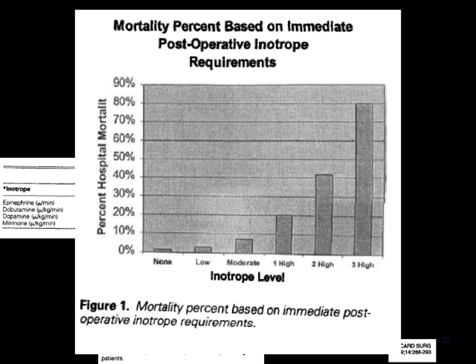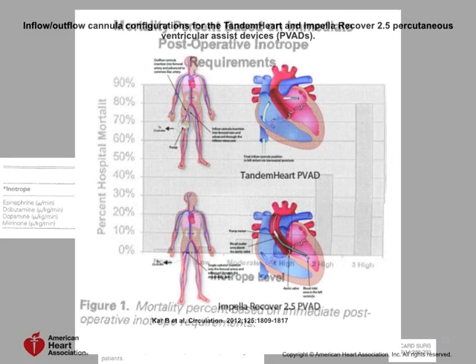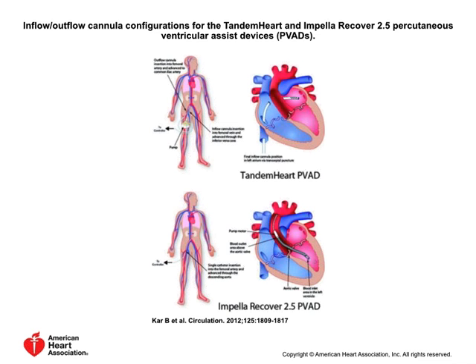They should be getting some form of mechanical circulatory support, and they might fare a little bit better. I talked to you briefly before about the Impella and the Tandem Heart. The key thing with the Tandem Heart is what this device does is they actually snake a cannula up the IVC. They puncture, your interventional cardiologist punctures the intra-atrial septum, drains blood from this, and then pumps it retrograde up the aorta. So this is essentially ECMO, what we do with ECMO, except we use the native lung for oxygenation.